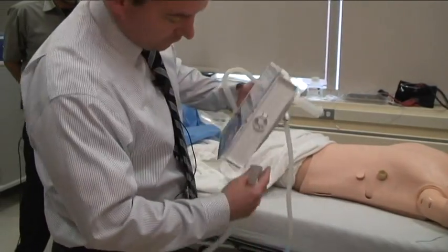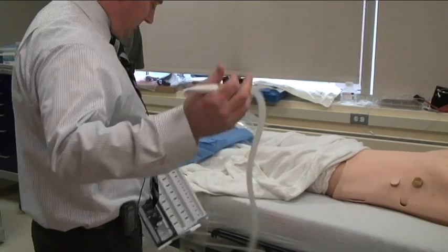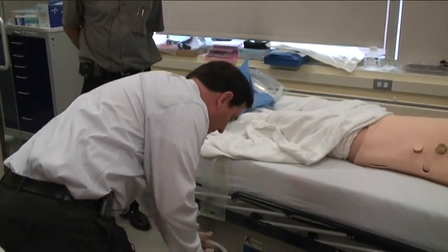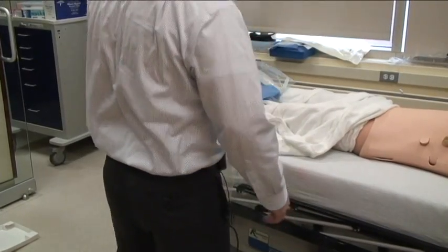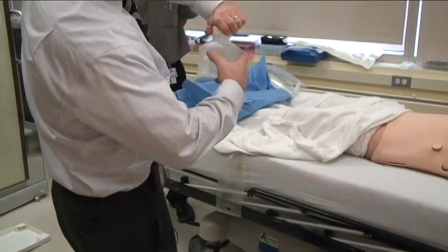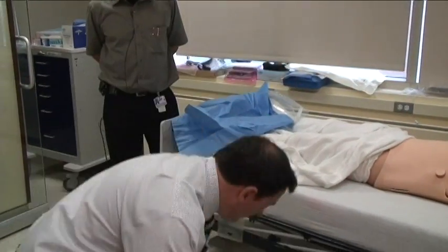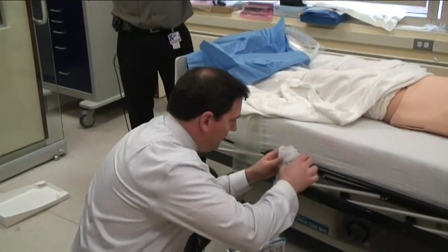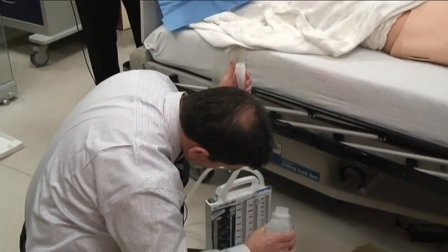So this will go on the floor. It has a thing here to spin so that it'll stand up straight. So, can you hand me that sterile water, please, Gopal? Sure. So for this part, I'm going to open up the water. Really, any water is okay. Make sure my valve is open. And you're going to pour the water into this collection. And you'll see it go in there.